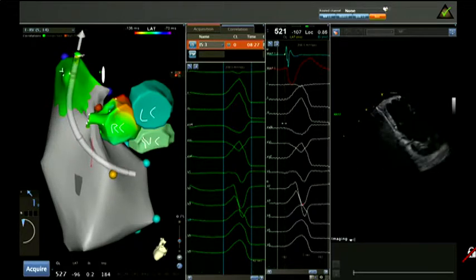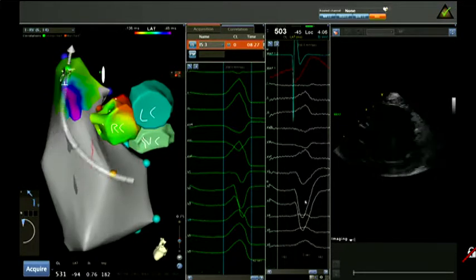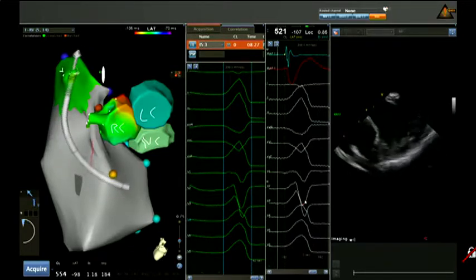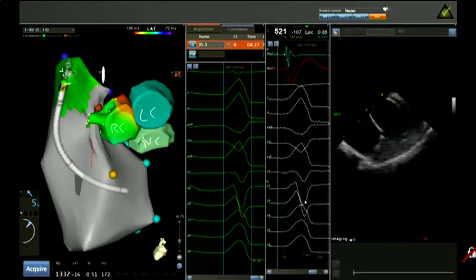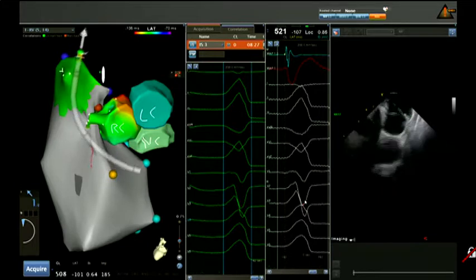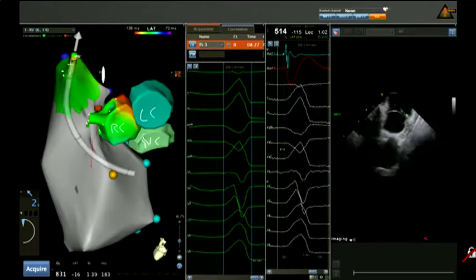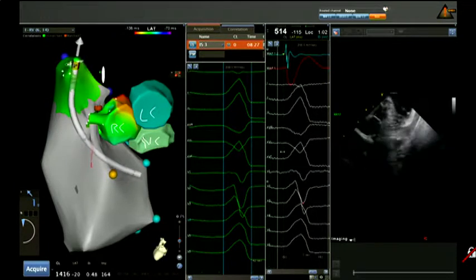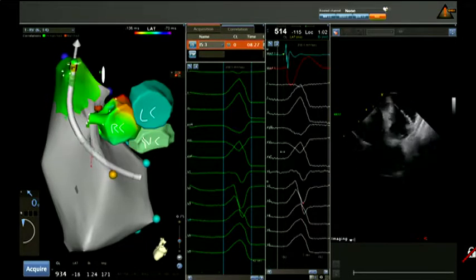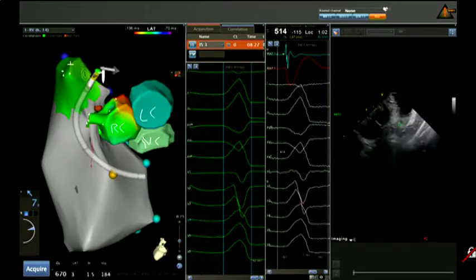But of course, when we pass our intracardiac echo probe to the right ventricle and we place it on the outflow tract, it turned. Let me show you here. In fact, you can see the valve. The ICE is an ideal method to distinguish the position of the valve, and this would be the free wall of the RVOT. You can see here to the side the aorta.